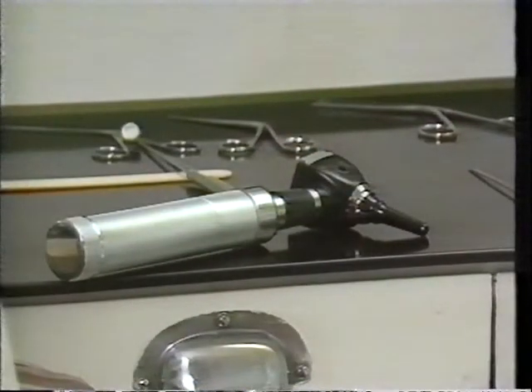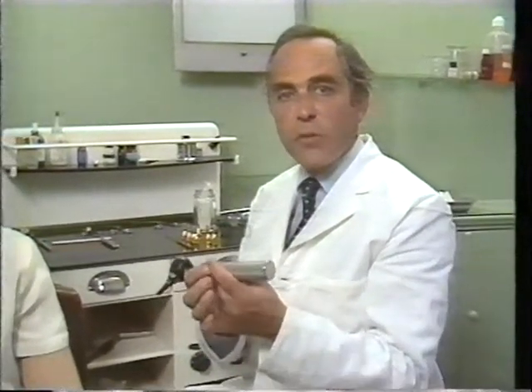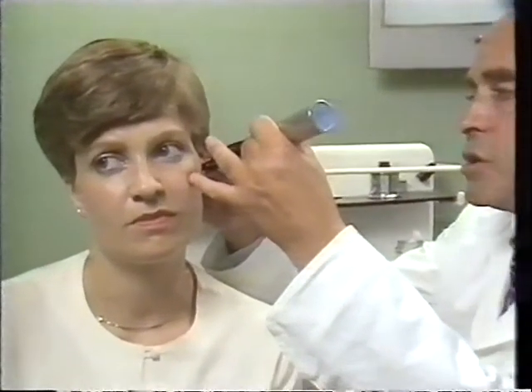The otoscope, of course, offers the advantage of magnification, and that is useful once a general view has been obtained. It should be held like a pen, and not, as sometimes is seen, like a hammer. And it's held like a pen with one finger extended at the side to protect against too deep penetration into the ear canal. The otoscopic field is much smaller than that of the naked eye. Though useful in general practice, the otologist wanting magnification would usually choose to use a microscope.